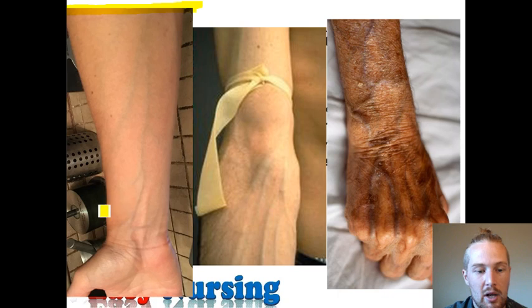And I'm not going to be starting anything probably from here down, because here would be the IV and then all the tubing would come down. That's going to be in the way of the forearm. So the forearm and the AC are both going to be giving issues with positioning. So I probably wouldn't want to start any lower than this.